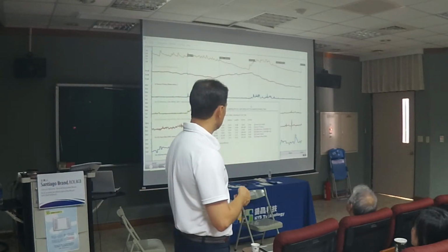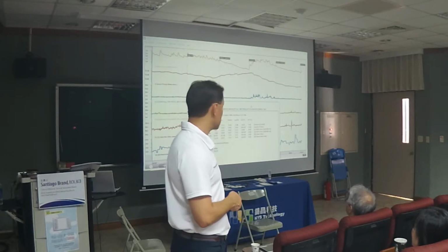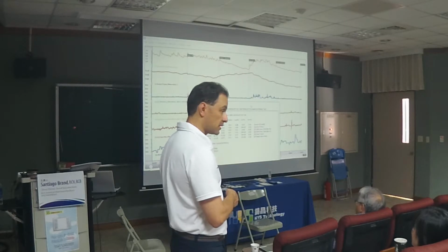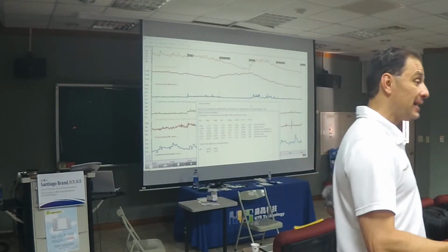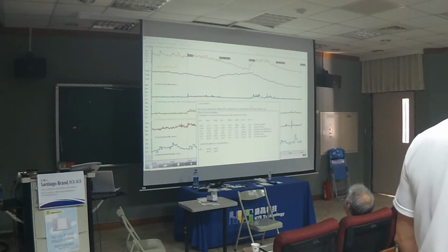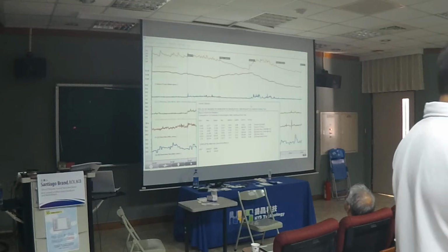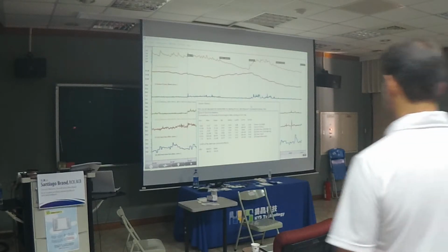Okay. But look at the GSR. It went up to 529. He recovered nicely. So again, he recovered with breathing, he recovered with the heart rate, and he recovered with the GSR, which tells me he's trainable. He's highly trainable. Well, everybody's trainable, but he's highly trainable. And because he's an athlete, he might have a natural innate ability to recover, which is even better, right?